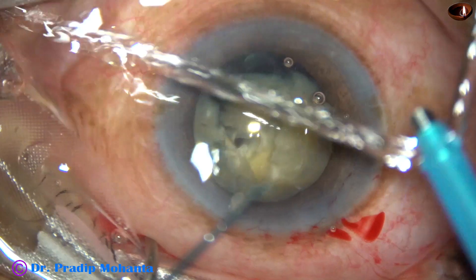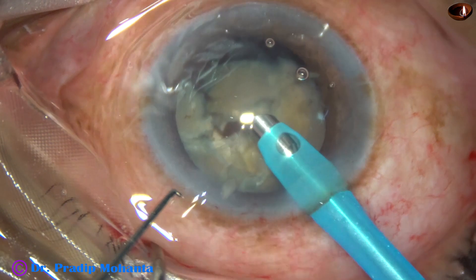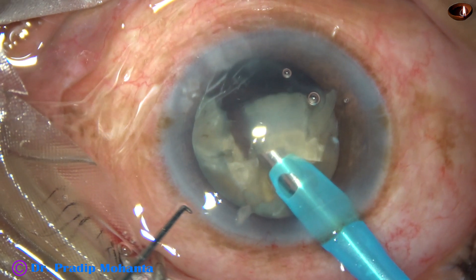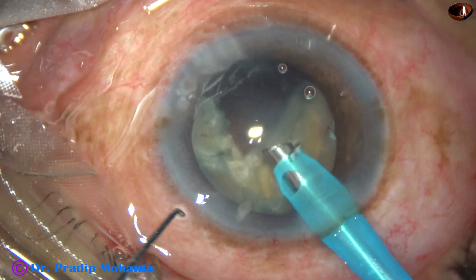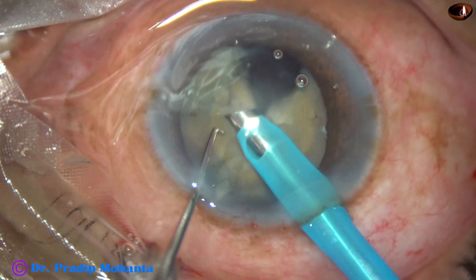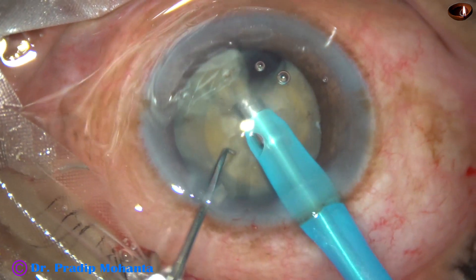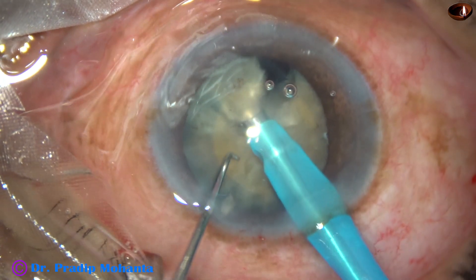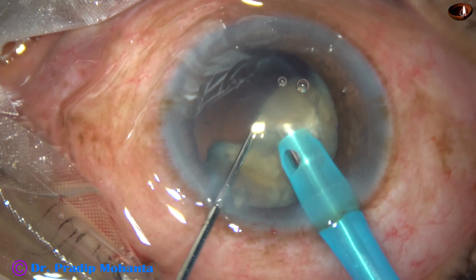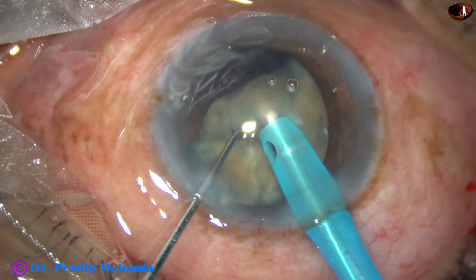The phaco power used in this case is 80%, flow rate is 35 ml per minute, and vacuum is 350 mmHg. Because there is a trampoline effect of the posterior capsule, I cannot use high vacuum. To be on the safer side, I have decreased the vacuum. I usually use 450 mmHg vacuum for surgeries, but in this case it is only 350 mmHg.